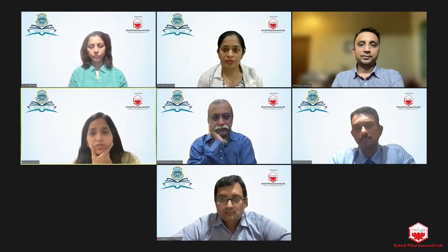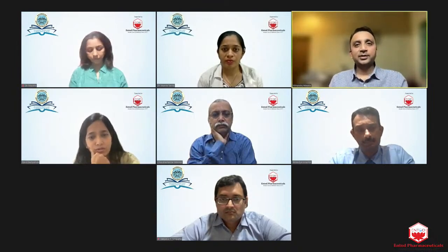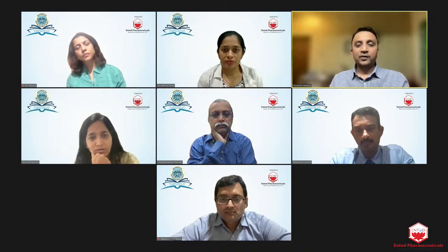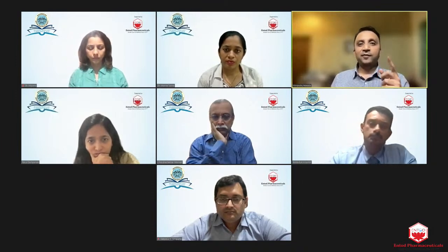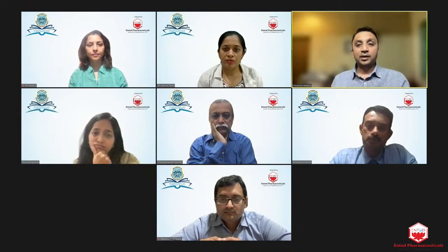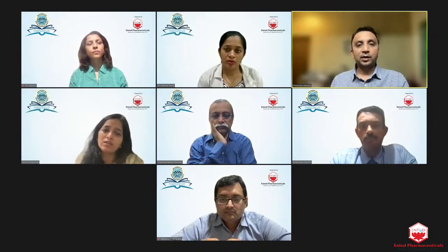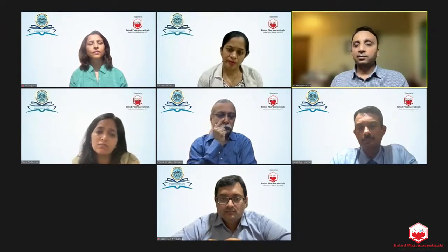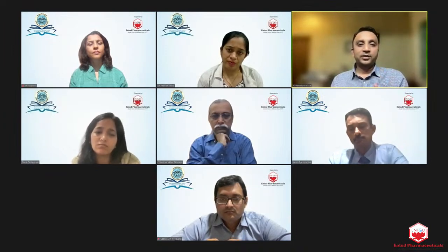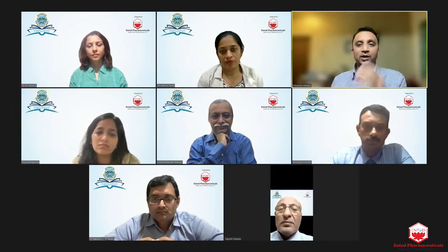What about you, Himanshu? Same thing. So as I said, I would look at centrality of the cone. If the cone is centered, and if my subjective and objective axes are similar, in that case, I would be really pumped up to think of a toric IOL. But believe me, most of the time when your objective method shows some axis, your optometrist gives you totally another axis.